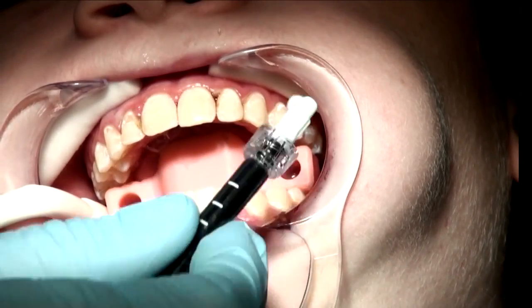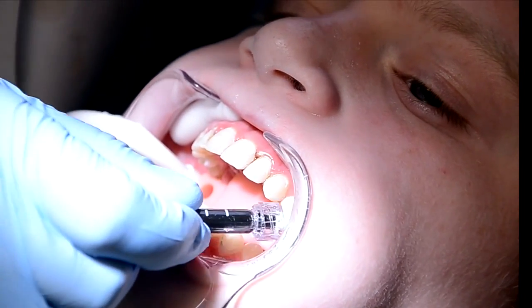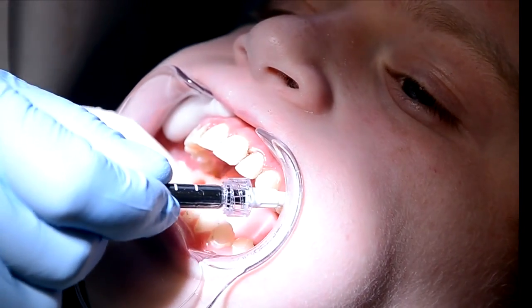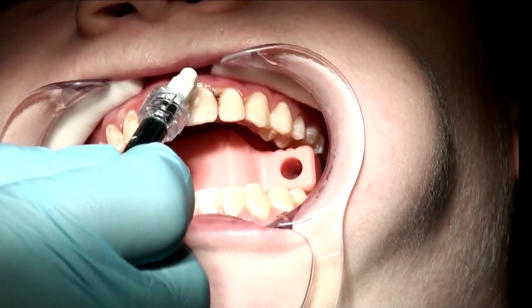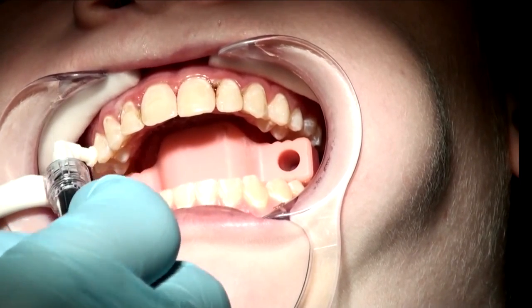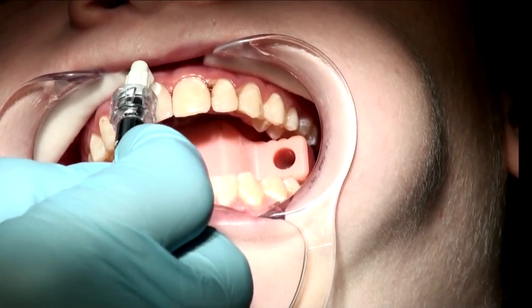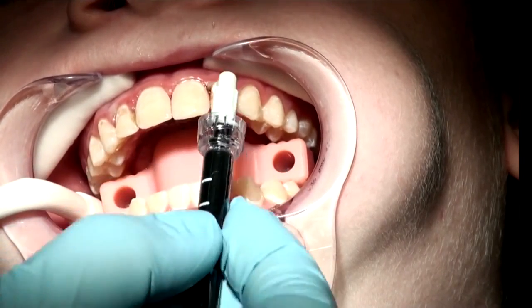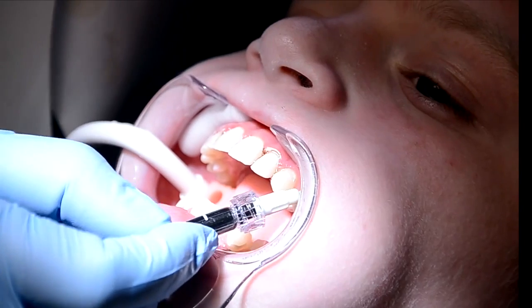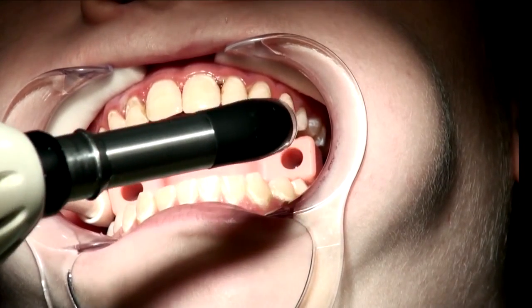The Icon is actually absorbed into the decalcified areas by capillary action, and it infiltrates down into the enamel and into the first third of the dentin, if necessary. I like to apply it and go back over it. I've even found that if some of the white spots are starting to be Class 5 caries, the Icon allows time for the patient to see their dentist prior to having the tooth filled, if necessary, without the caries lesion becoming more severe. Light cure for 40 seconds, curing each tooth individually.